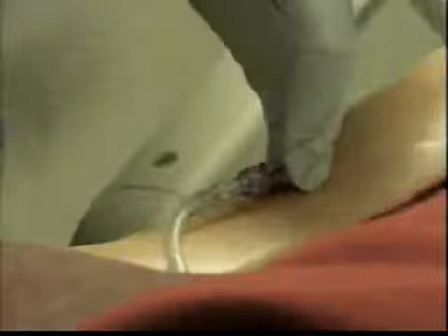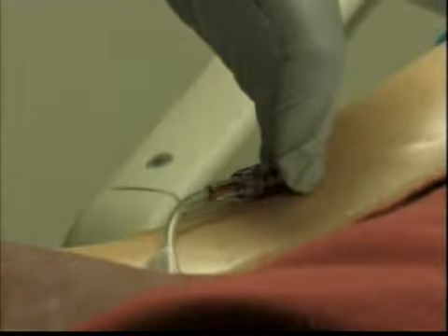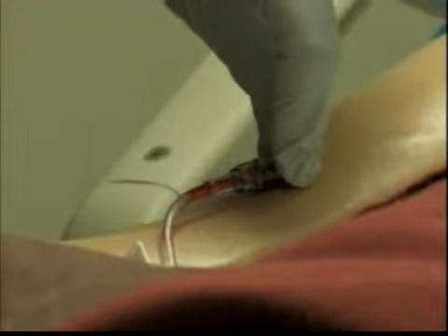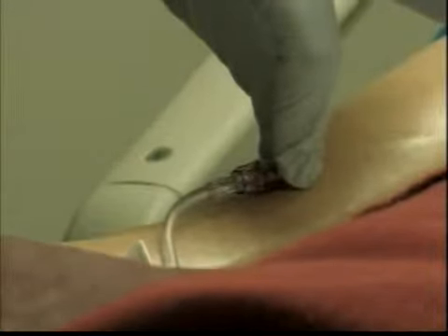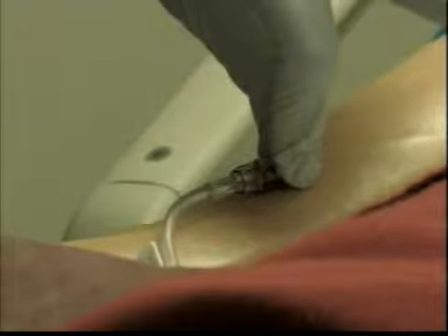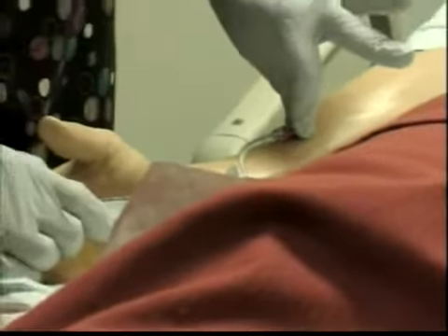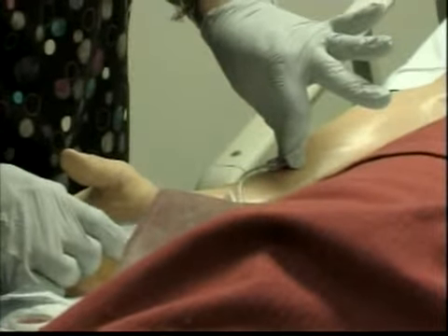Okay? You have extra gauzes that you can use to clean, to remove any extra blood. Then you're going to aspirate, make sure that it's still in place and you see the blood. You're going to flush the system with the amount of saline that you have in there. Pay attention to my fingers. I'm not touching the side at any time. I give it the flush.